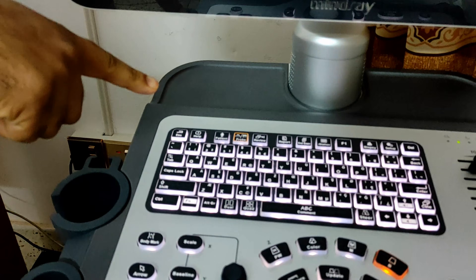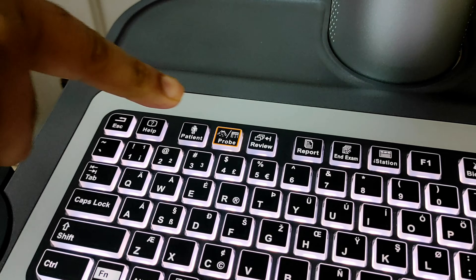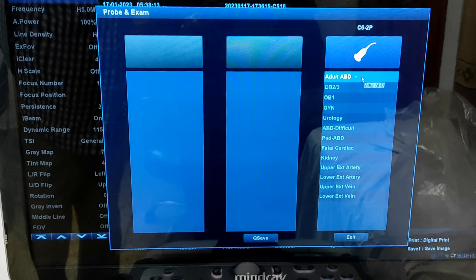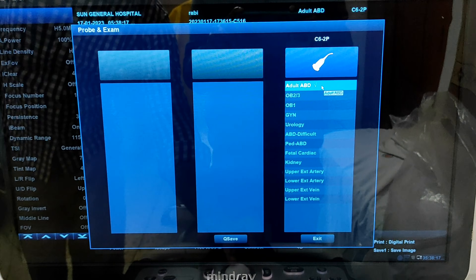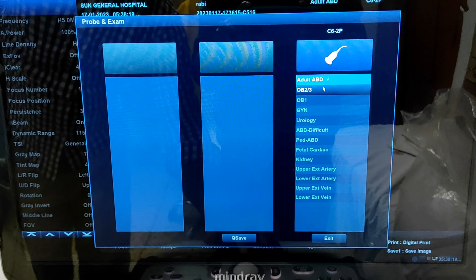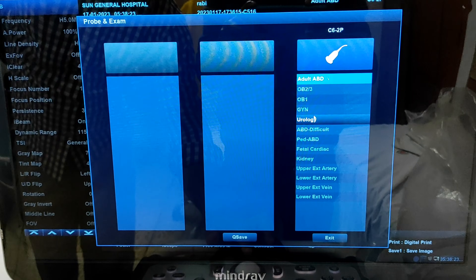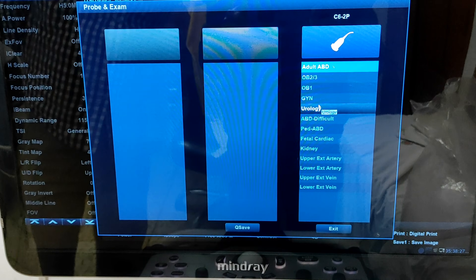On the keyboard, the yellow highlighted one is the probe button. To move into a different examination system, you have to press on the probe button. Here are the different examination systems: the first one is abdomen, second is obstetrics second and third trimester, third is obstetrics first trimester, next is gynae, then urology.